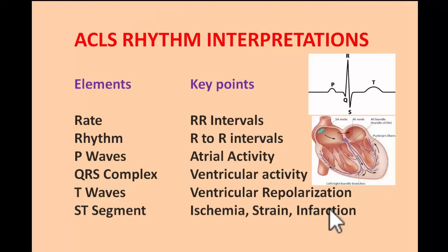Let us learn something about ACLS EKG strip interpretation and management of underlying rhythm problems. So let us start. Before we look at a rhythm strip and determine what kind of rhythm we are looking at, we need to have some basic understanding of what are the things we need to look for.